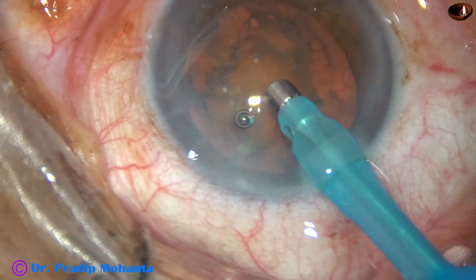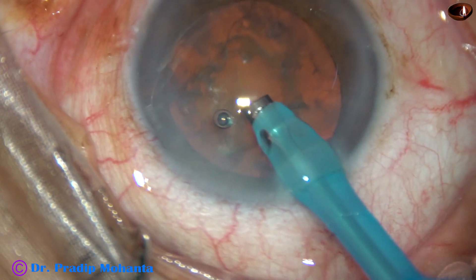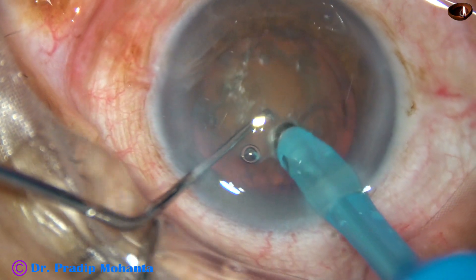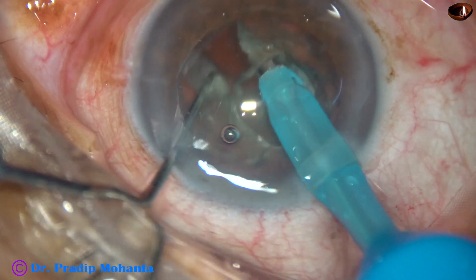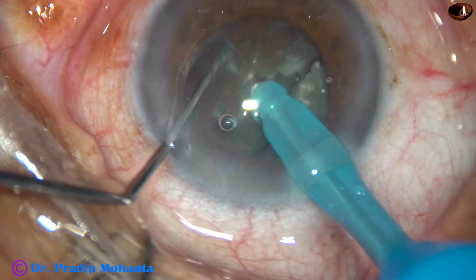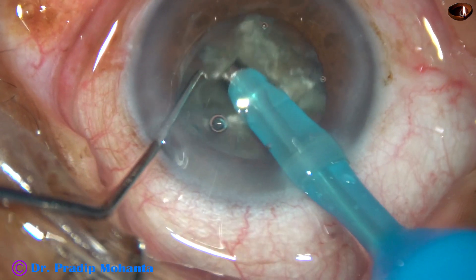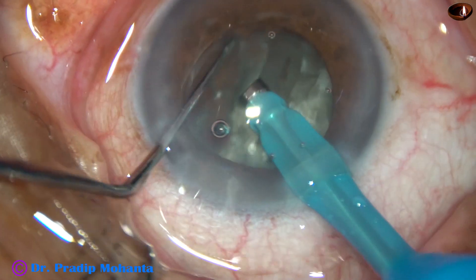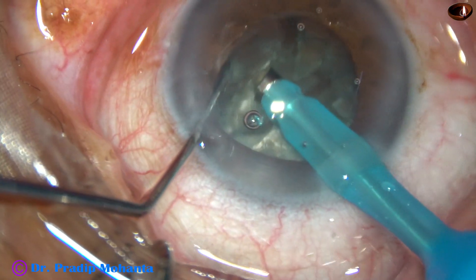I removed some superficial cortical matter, but in this case, since the nucleus is quite hard, I could not remove much of lens matter. And this is what I call submarine chop. The tip is buried completely into the substance of the nucleus; it travels through the nucleus like a submarine, and the nucleus is chopped. This hemi-nucleus is again chopped into two large fragments. The nucleus is rotated, and this is another fragment, and one more chop. So we have got six fragments.